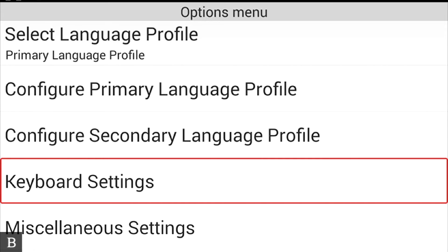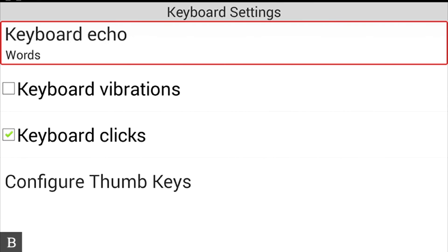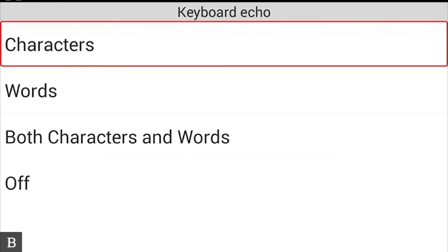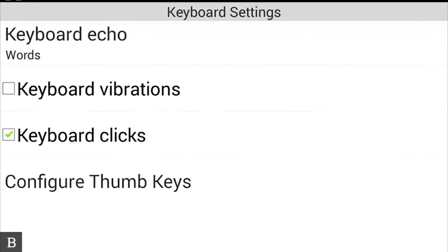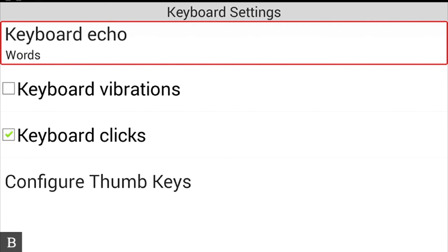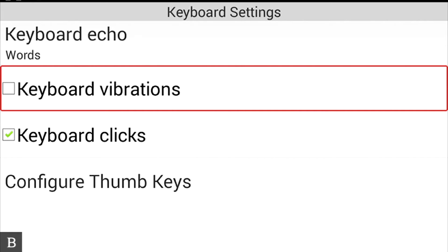Next is Keyboard Settings. The first option is Keyboard Echo, currently set to Words — meaning it speaks each word as you type. You can change it to characters, both characters and words, or nothing. I prefer just speaking words since I'm a fast typist on the glass. You can also enable Keyboard Vibrations, which vibrates every time you type a character — useful when first starting with touch Braille — though I prefer not to have that on.